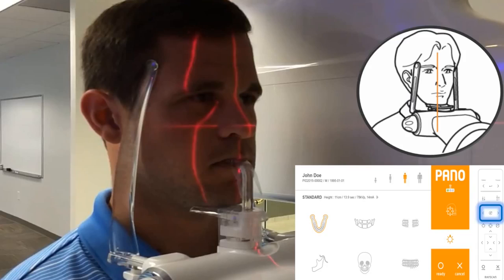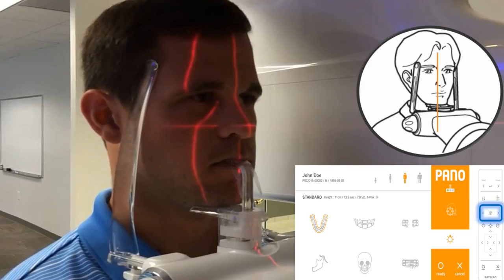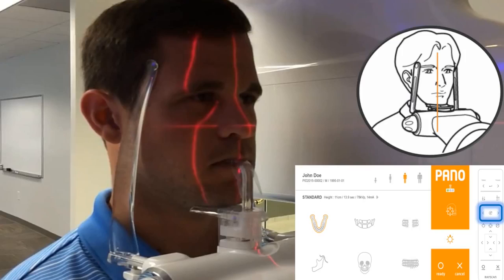Ask the patient to maintain a firm grip on the hand grips and to step forward slightly. This position puts them slightly off balance and hanging onto the support handle, forcing them to stretch their neck as far as possible, which decreases the spinal shadow on the anterior regions. Ask the patient to press their lips together and press their tongue against the roof of the mouth. Closing their eyes will help them remain still.